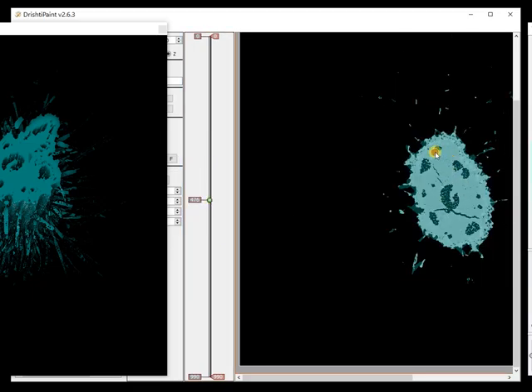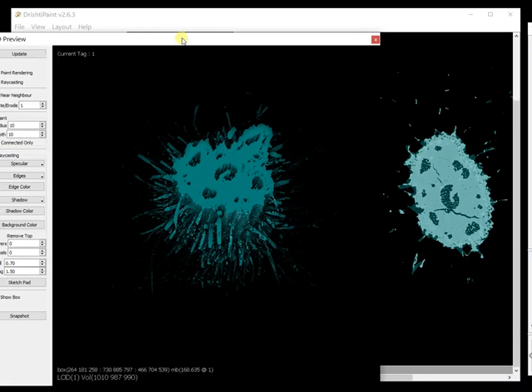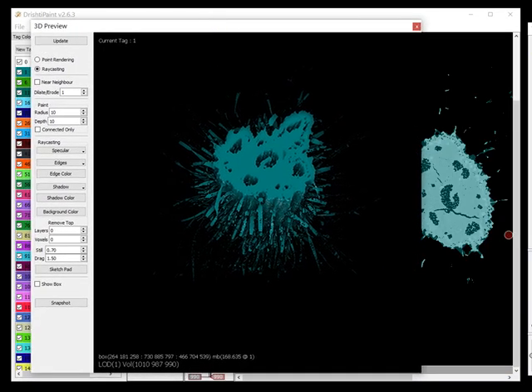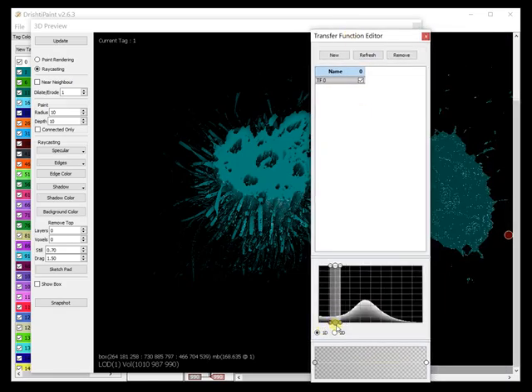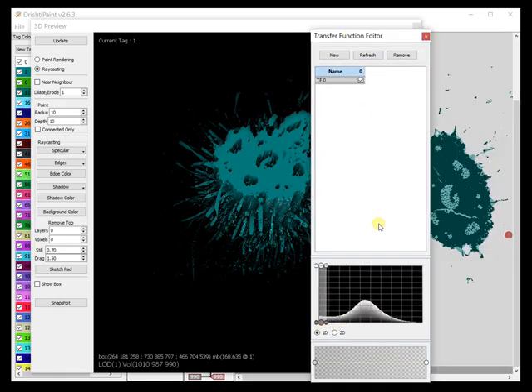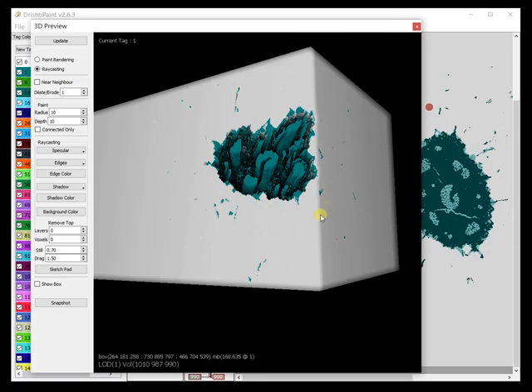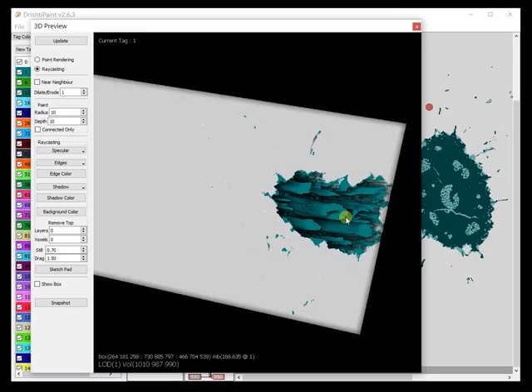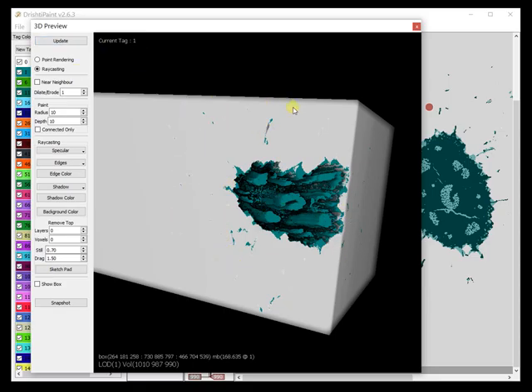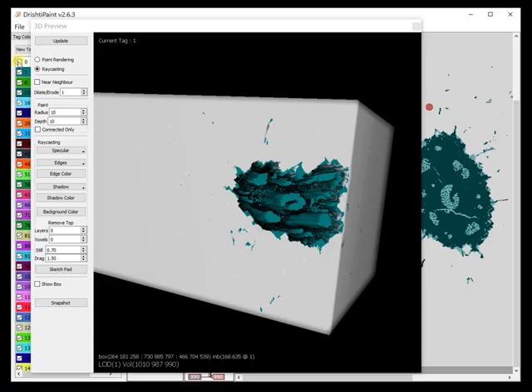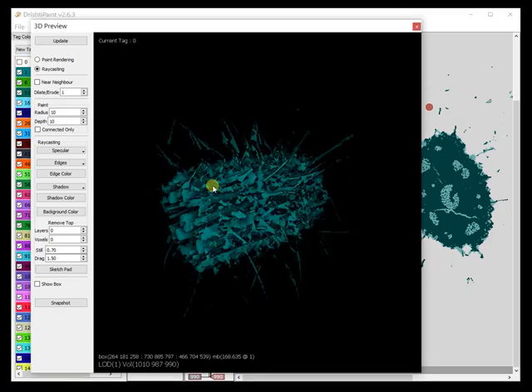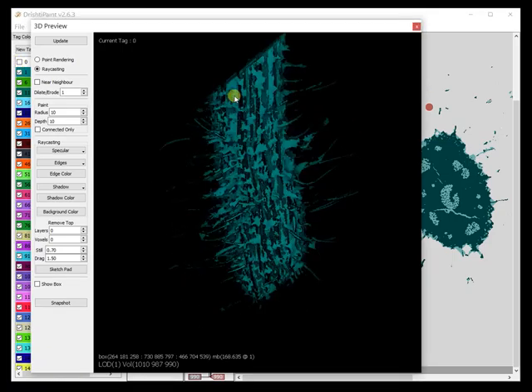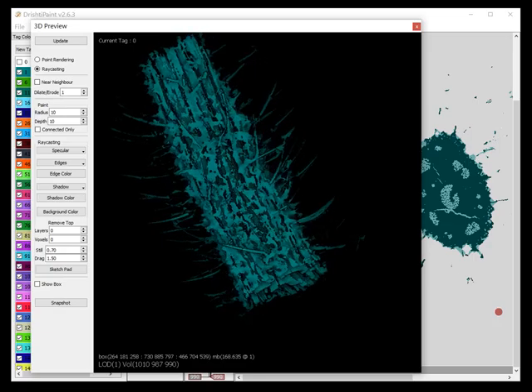Now since we are only interested in this region here and not these outer regions we can remove those outer regions. Let us change the transfer function so that we are looking at the outer region as well as the inner region. We can turn off this white part which is tag 0. I have turned off tag 0 and what I plan to do is now select these individually.